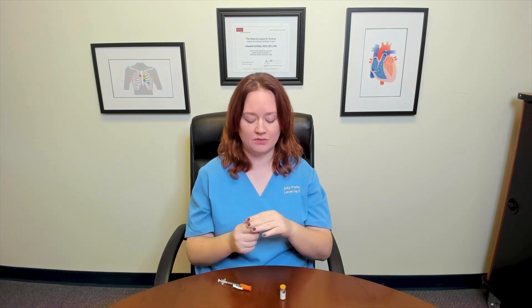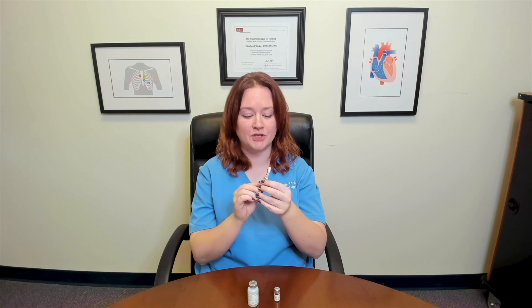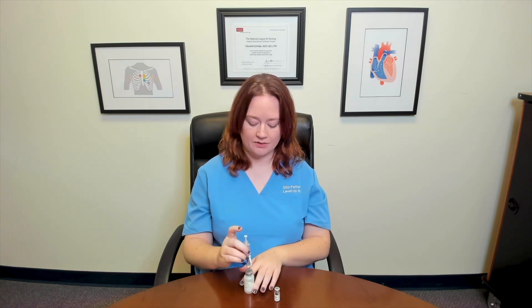Let's go ahead and do all the steps together. The first thing I'm going to do is just pop off my caps. Because these are new vials, I don't need to clean the caps. I'm going to take the lid off my insulin needle. We're going to do five of each type of insulin. So first I'm going to pull my plunger back to five — get five units of air in my syringe — and insert five units of air into my cloudy vial.